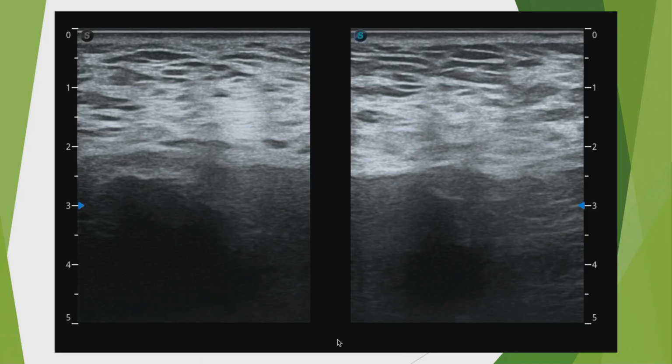Pain really did stick always, I remind you of that echo palpation story. As soon as I pressed on the probe, it really hurt there. So it was a good fit here with what we're guessing is the ischium, which is really the bony area of the pelvis on which this tendon is going to insert. But even so, the image is largely insufficient to say anything about it.